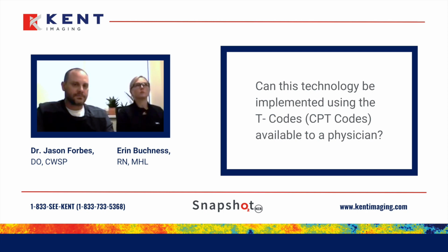Can this technology be used and billed using the T code in a physician's office currently? There are multiple codes. Right now we use 2 codes within our clinic. It's the actual obtaining the image and then the read of the image. But there are other T codes. The NIRS company we work with has a great resource, but there are currently 4 T codes that can be applied with obtaining the NIRS images, yes. And one is in a physician's office.